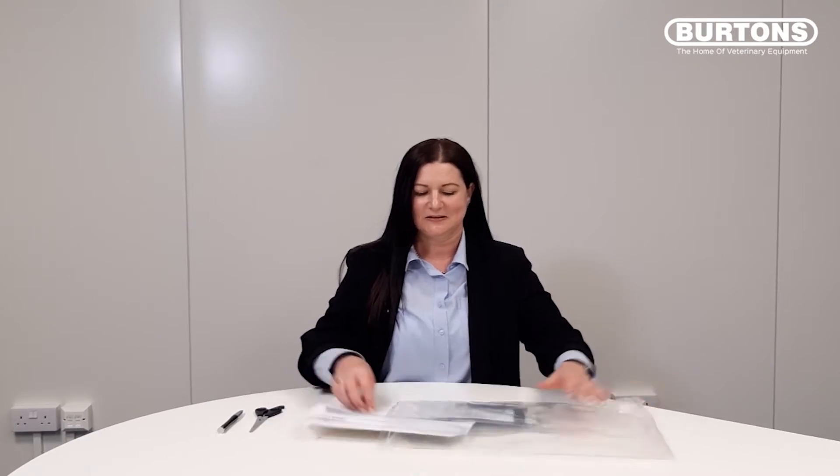You will receive your kit from us which will contain the following items: your badge kit, a sample form and a return envelope.